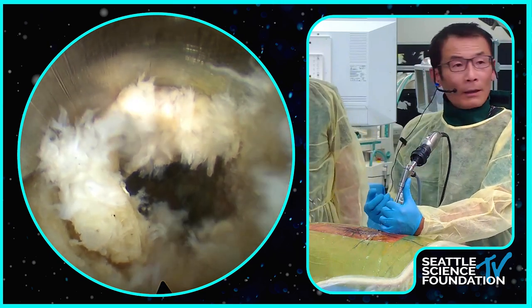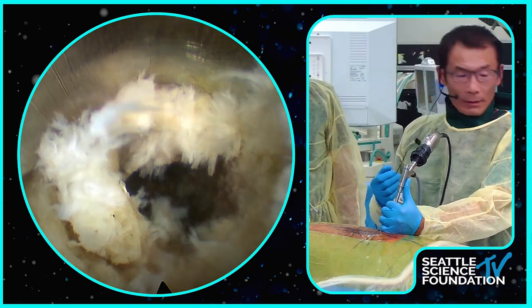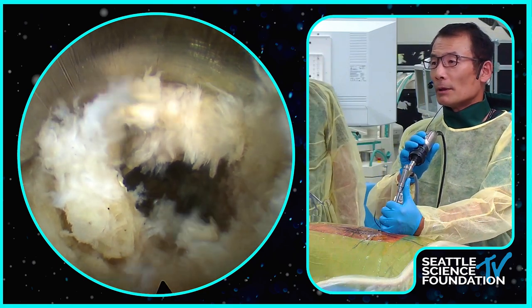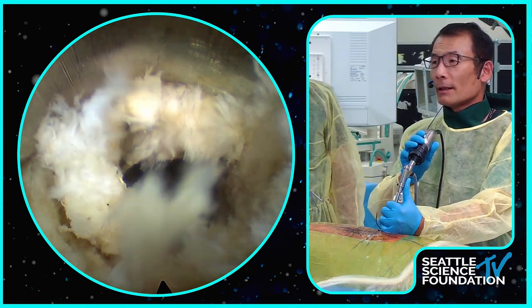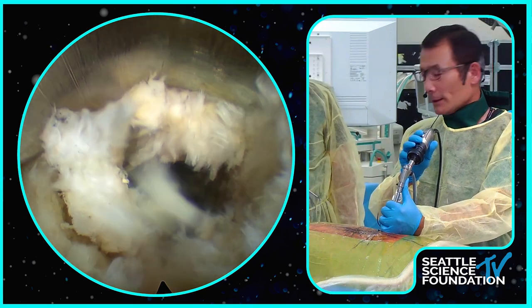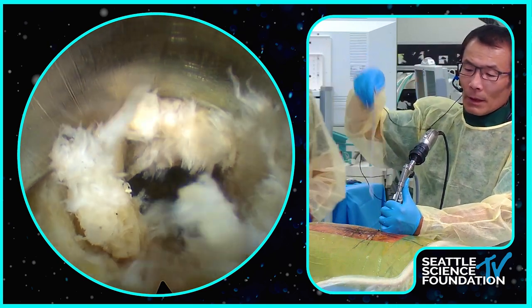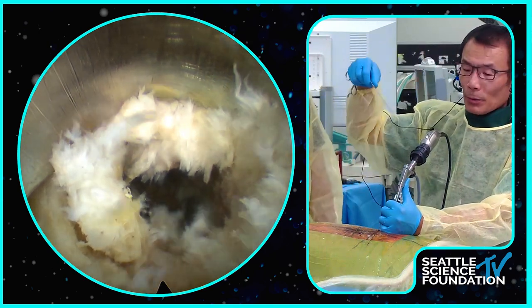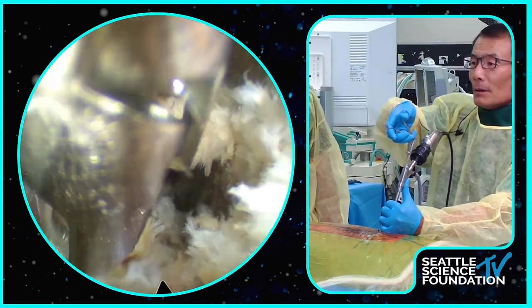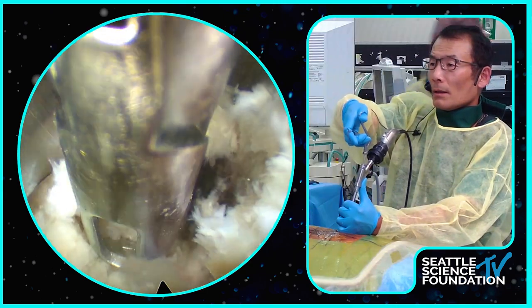So, Shen, what endoscope do you typically use? Do you use a small one? No, this is a central stenosis scope. So a larger endoscope. Right. The working channel, the cannula, is about 10 or 11 millimeters. Okay. Big grabber. We can wait for the x-ray to place the cage because we want to look at the lateral. So, Ray, are you ready to show us where you are with your transforaminal approach?